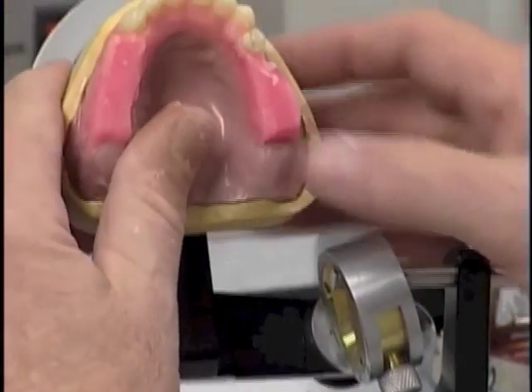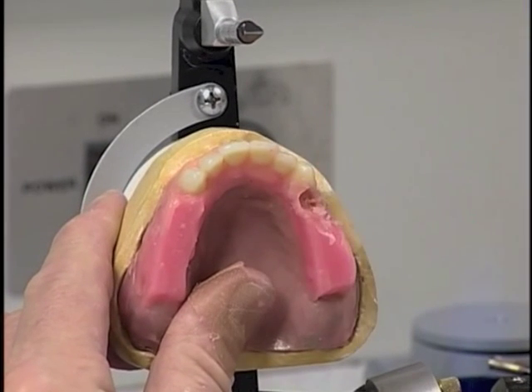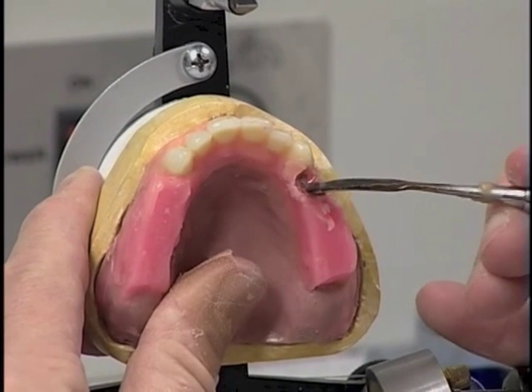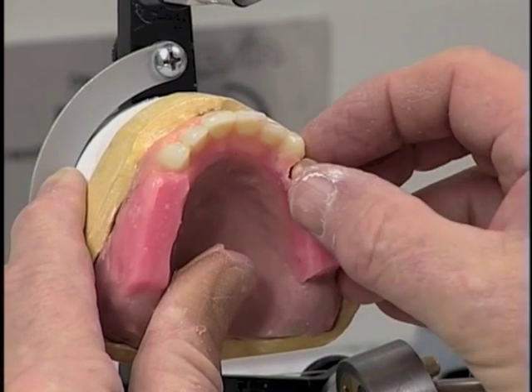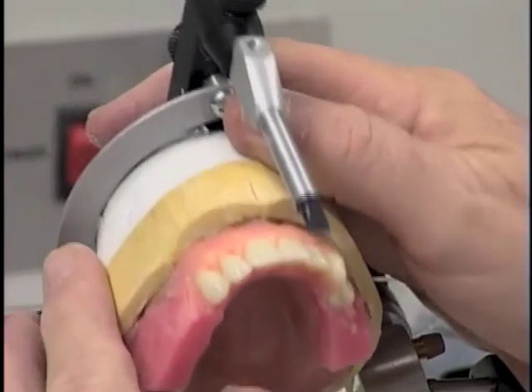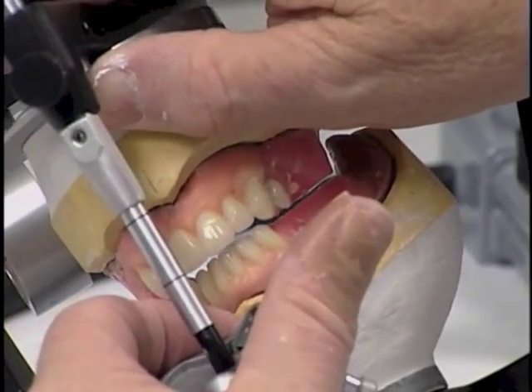In order to do that, we're going to have to remove the tooth once again. Pull the wax in that area. See if we can arrange that tooth now in such a way that the buccal cusp and lingual cusp are at about the same height.